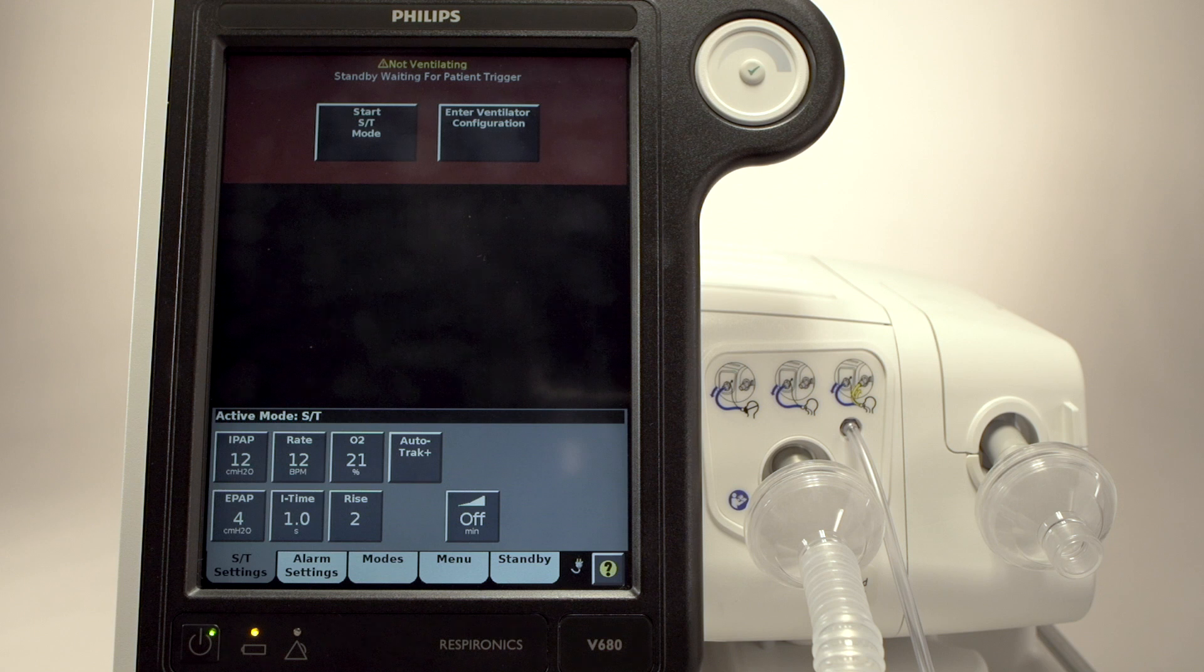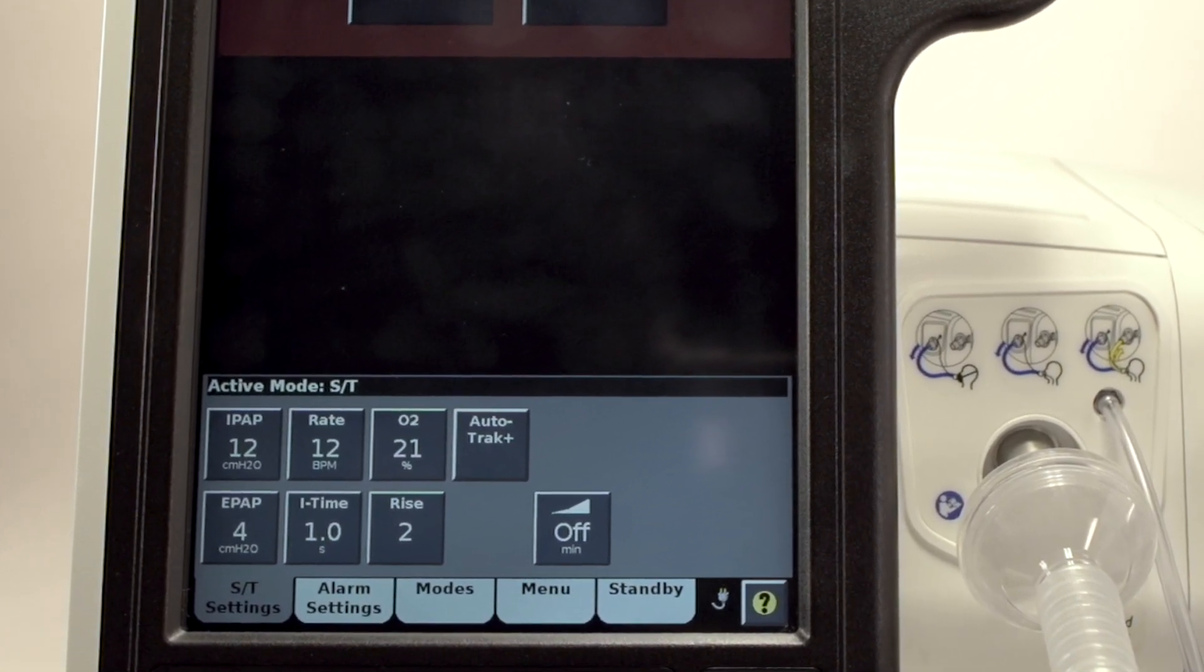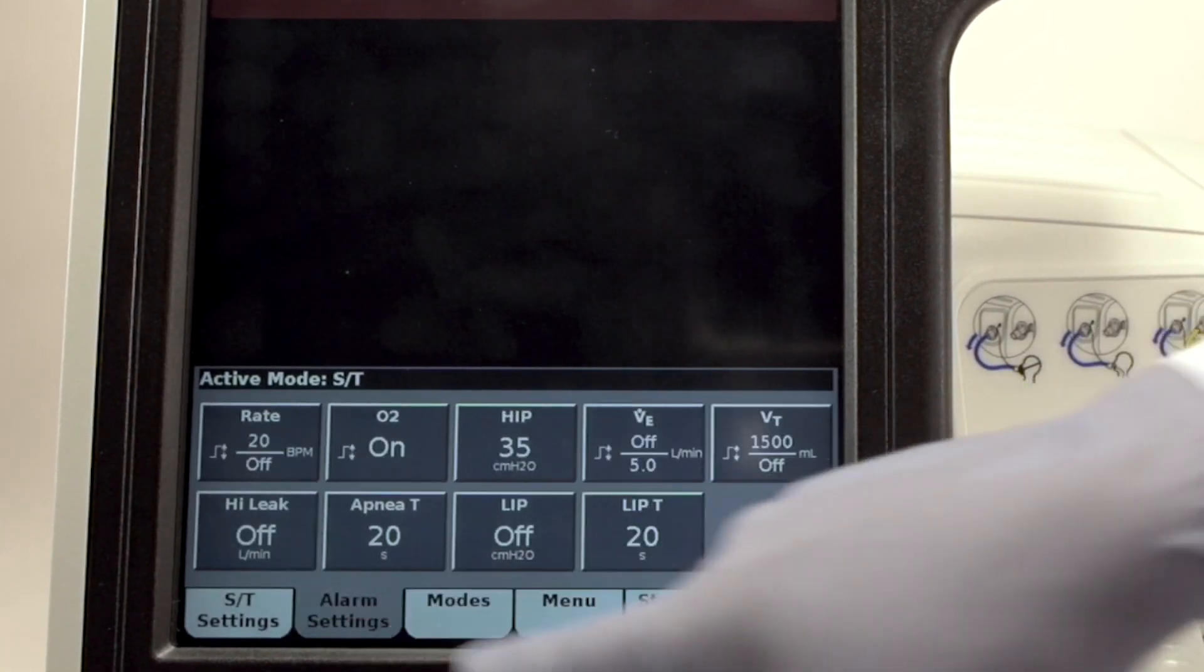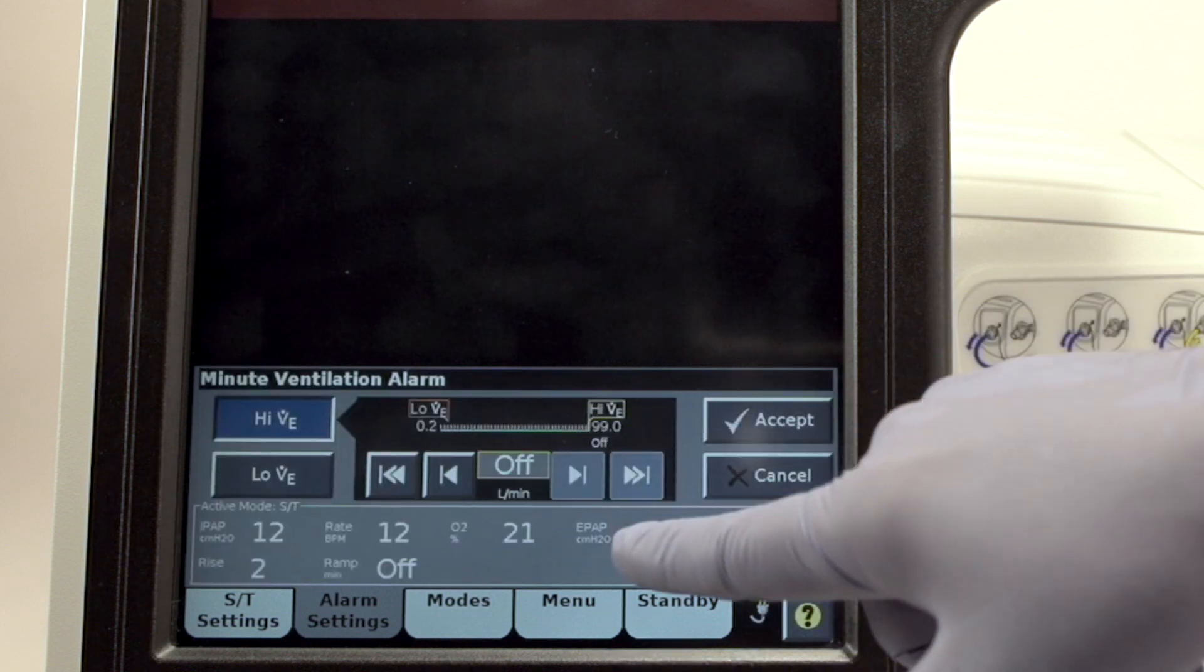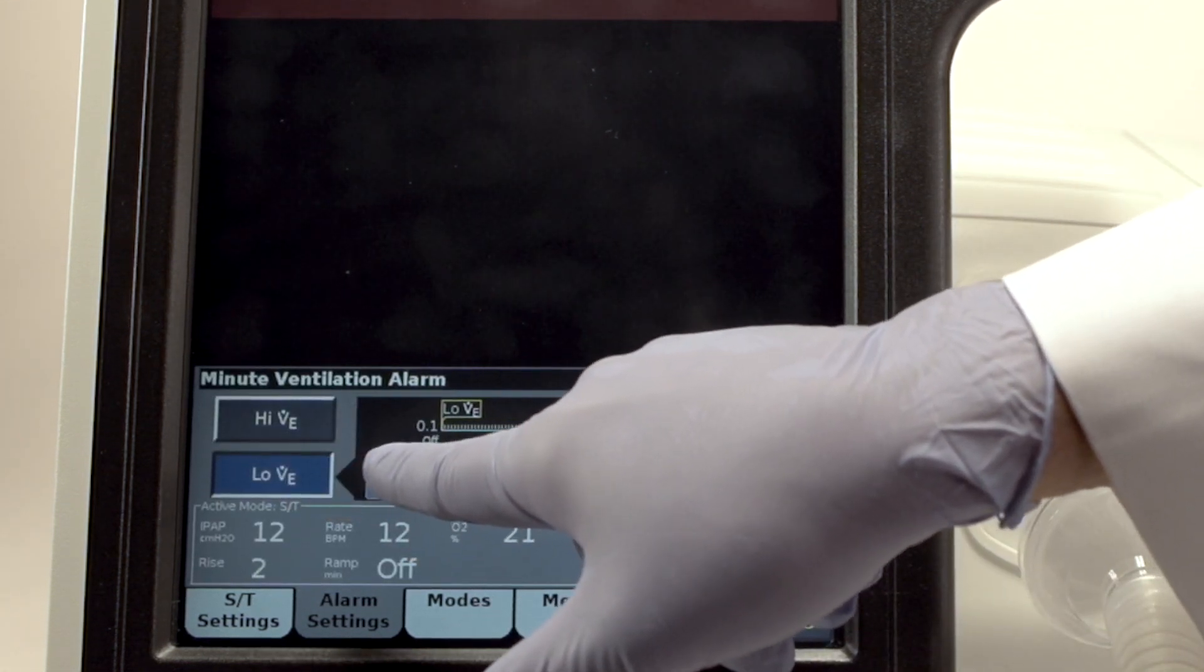Before ventilation commences, you can review all of your alarm settings and make appropriate adjustments. Let's fine-tune a few alarms. Simply touch the alarm and adjust the setting with the arrows. When you are ready, connect your patient and V680 will automatically start ventilating.